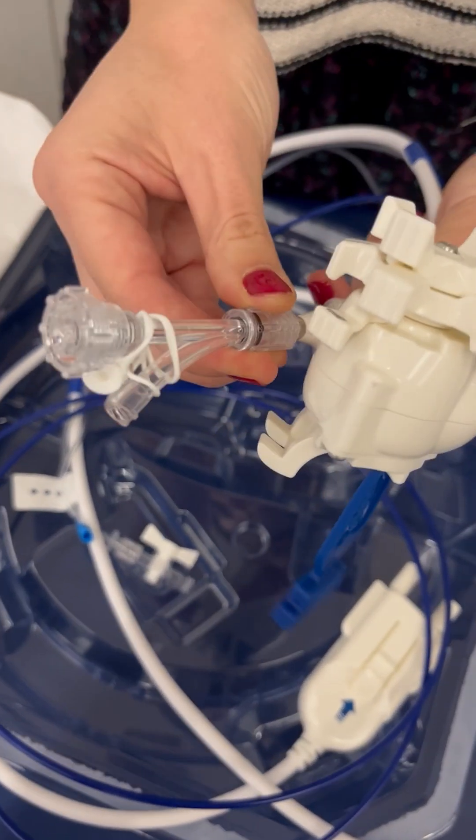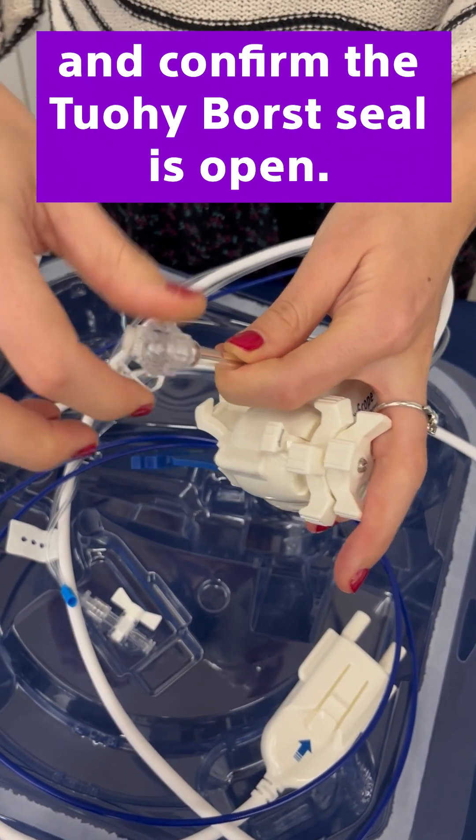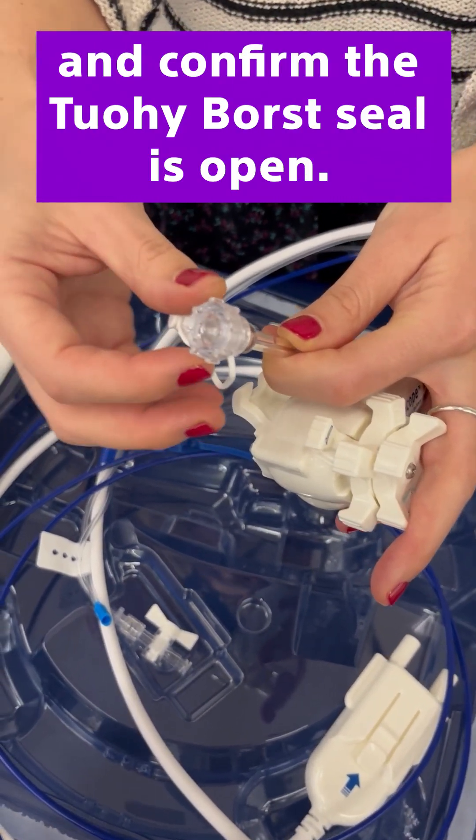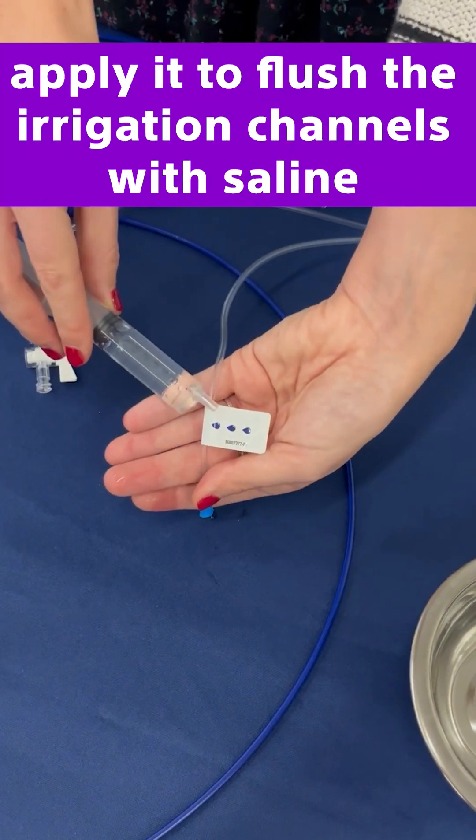If you're using a Y-Port adapter, attach it to the SpyScope DS2 catheter and confirm the Borst seal is open. Connect the irrigation pump to the port and apply it to flush the irrigation channels with saline.